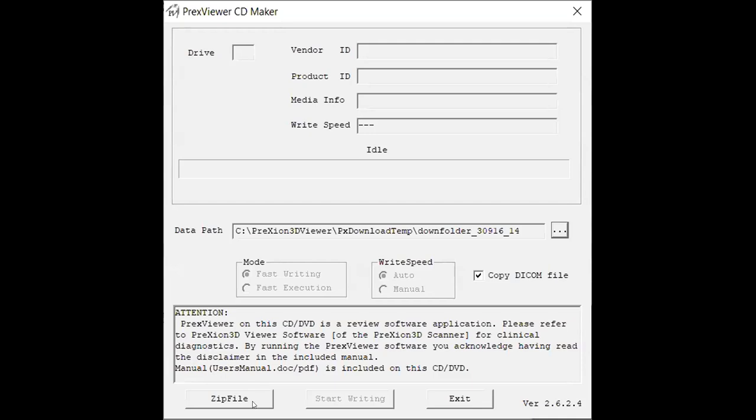The first option listed there is zip file which is what you'll want to select if you prefer to save your patient's files onto a USB. But if you prefer to save those files onto a disk you'll then instead want to select start writing.